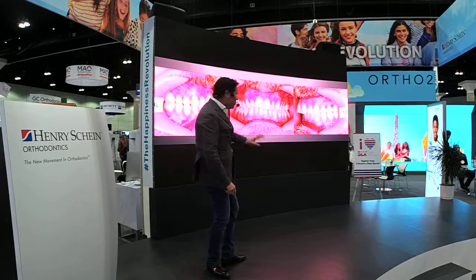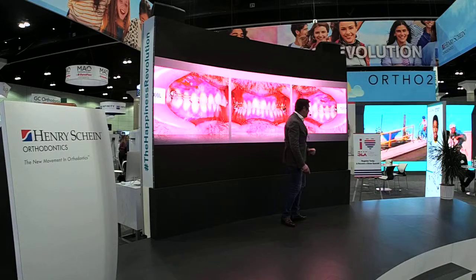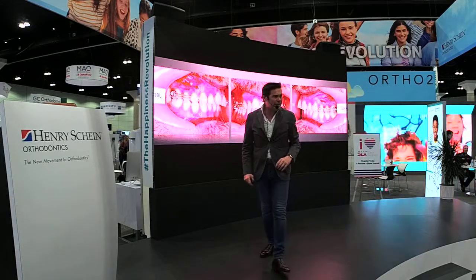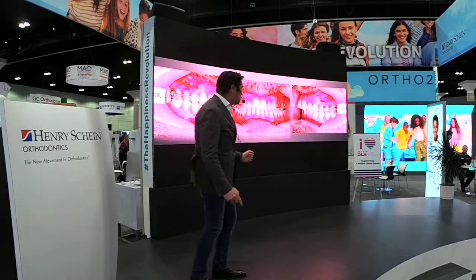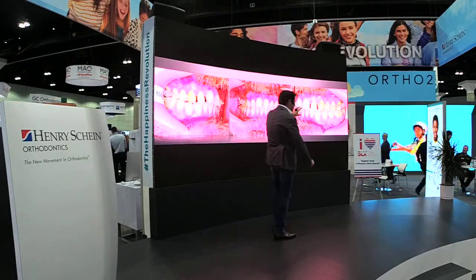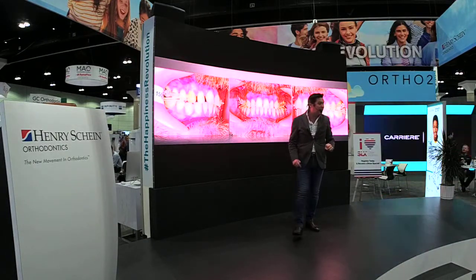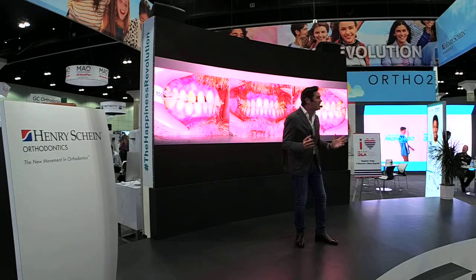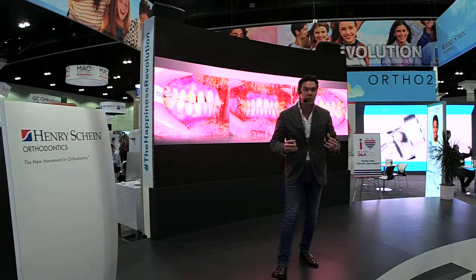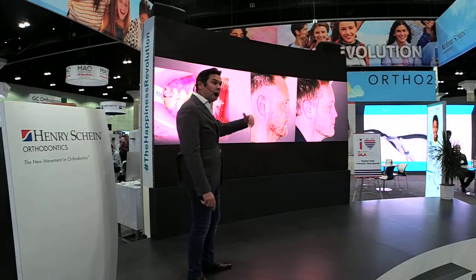So the case is a 40-year-old, class 2, retrusive mandible, so we intend to bring everything into the correct relation. How do we do it? We place the Motion class 2 appliance, the clear one, and the objective is to place the elastics and convert this case into class 1. Once the case shows a beautiful, solid class 1 of molars, premolars, and canines, now this case is much easier to accomplish with a solid, easy, short treatment with aligners. Now we can remove the Motion and change into aligners.